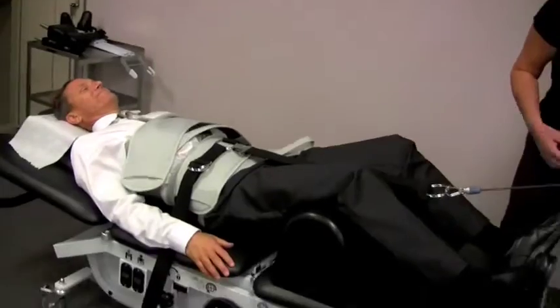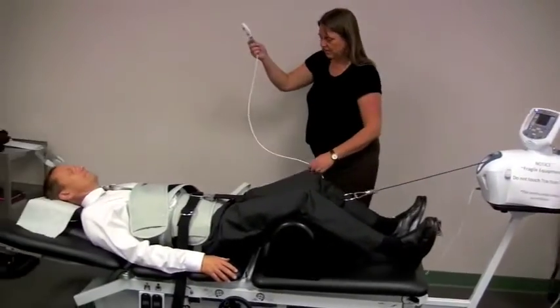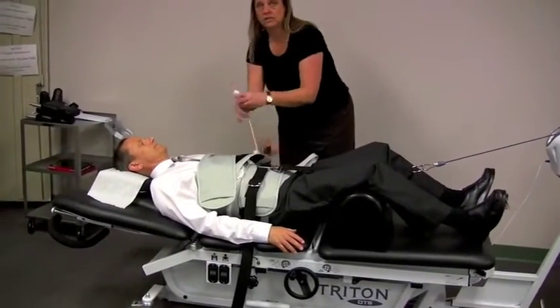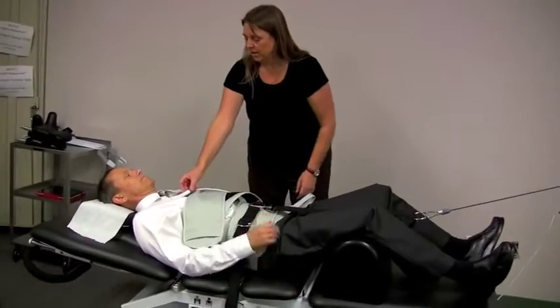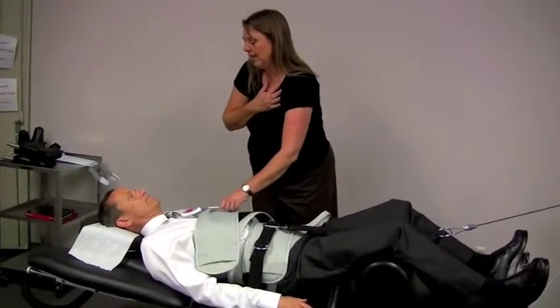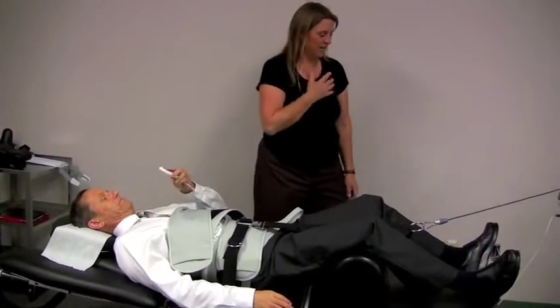Ready, patient? I'm ready. Okay, I'm going to hit the start button, but before I do, it is fair for me to hand to you this thing called a patient interrupt switch. And I like to feed it through this little hook there so it doesn't fall off the table, and put it right over the heart. So if he has anything, he just touches his heart. Okay, on the left side is probably better, huh? And you can stop it. So just reach your hand up with your right hand, you'll hit it. Okay?